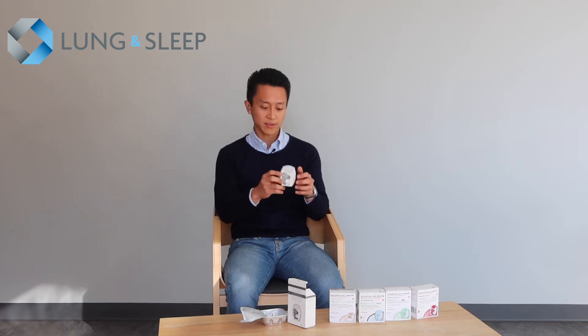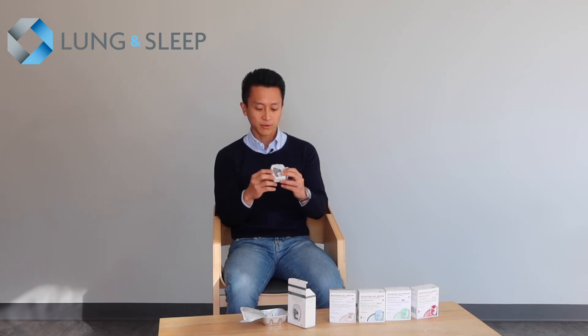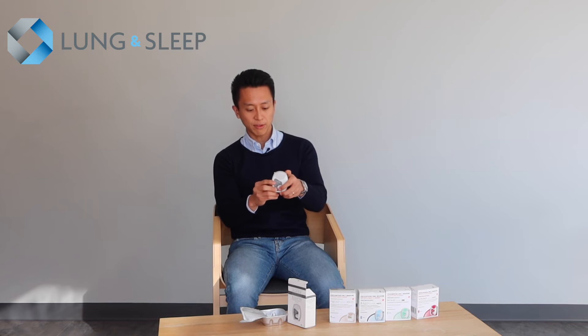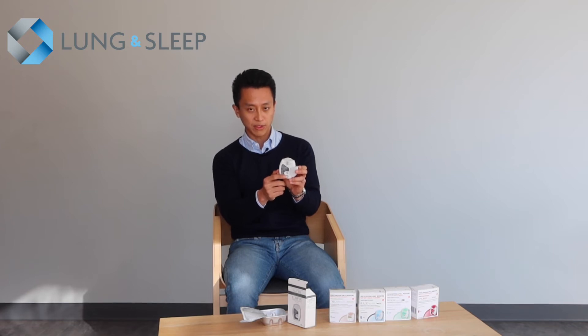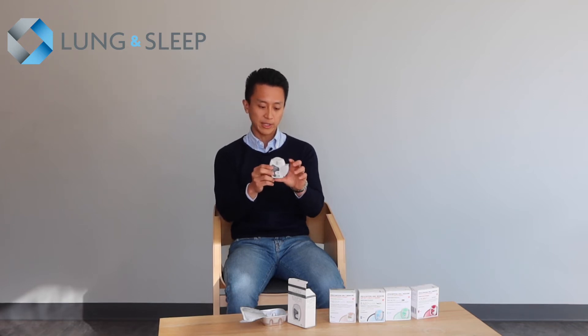When you're ready to use the Ellipta device, you flip open the lid and you will see a mouthpiece with a nozzle. It's a dry powder inhaler, so it's important not to blow into the nozzle as it might disrupt the powder. When you flip open the lid, the dose counter will reduce by one — that's how you know the dose has been loaded. There's also a click when the lid is fully open.